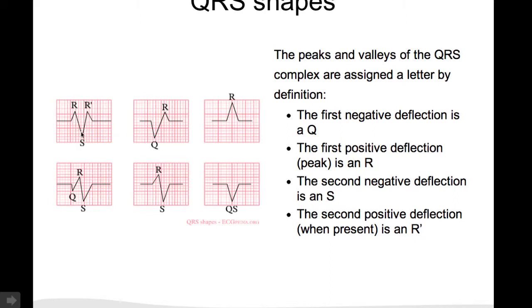The first negative deflection after the first R wave is an S wave. And if you have a secondary R wave, it's called R prime.